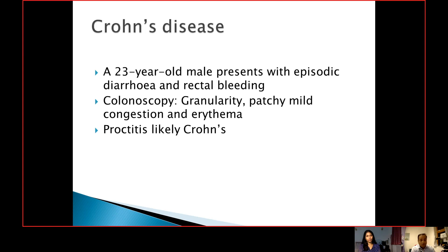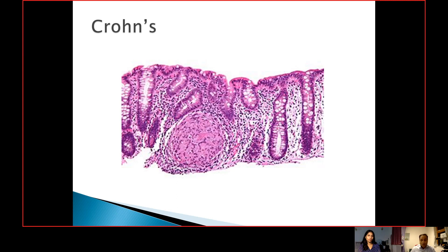Our first patient is a 23-year-old male who presents with episodic diarrhea and rectal bleeding. Colonoscopy performed showed granularity and patchy mild congestion and erythema. The diagnosis made was proctitis, most likely Crohn's. On histology, as you can see, this is the superficial fragments of large bowel mucosa.